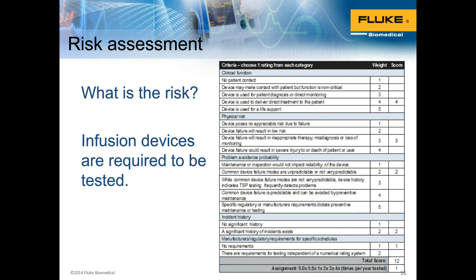So if you don't already have that, a lot of organizations have that already for the medical devices that are tested. But if you don't, then you're welcome to use our guide to assess how critical it is to test an infusion device. So that's the first thing, is you need to do the risk assessment for each one of the medical devices that you have or that you work with to understand what is the risk associated with each one of these devices. The second thing is compliance.